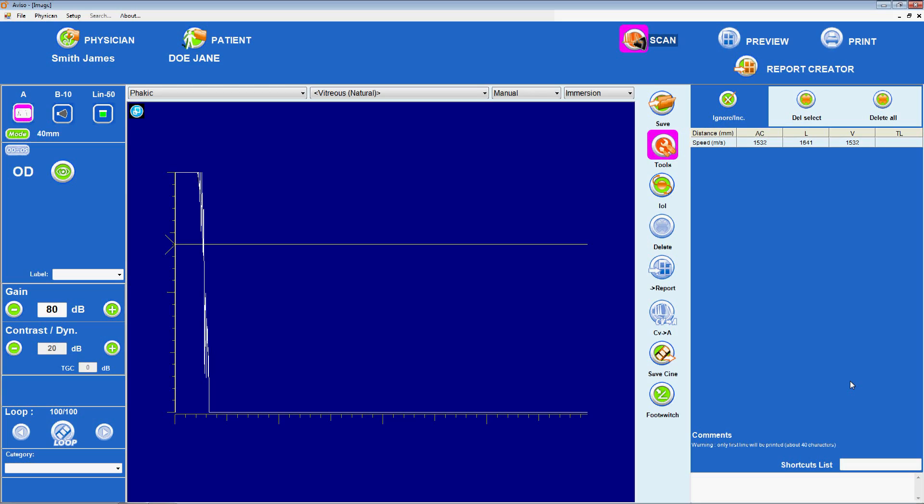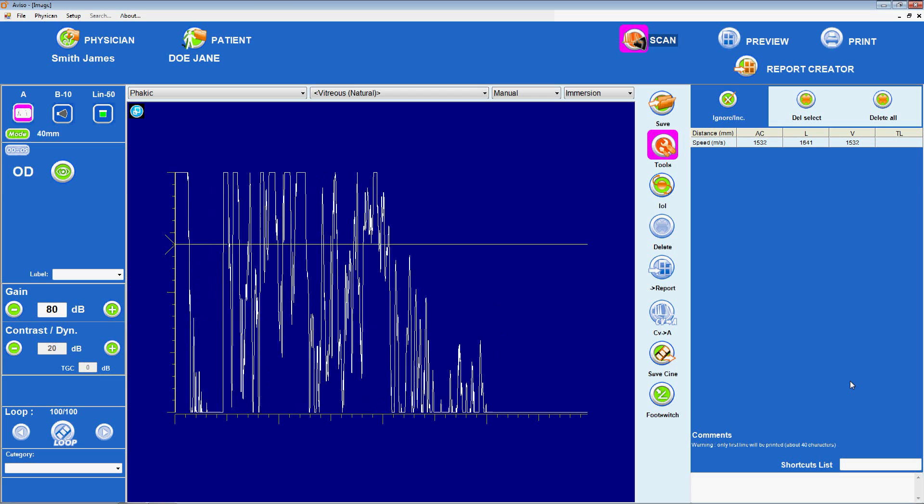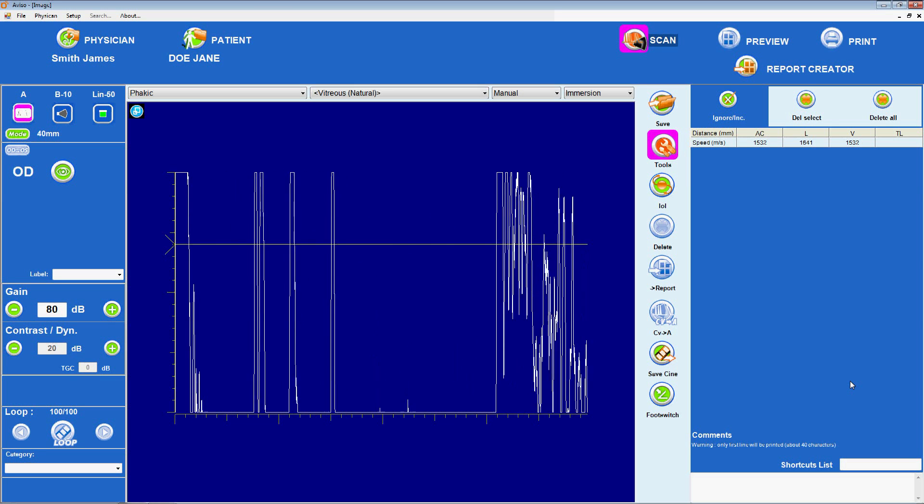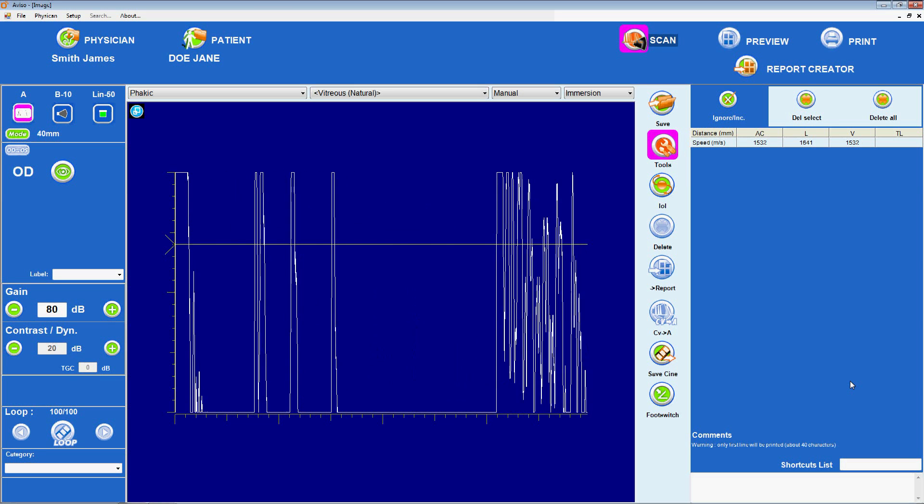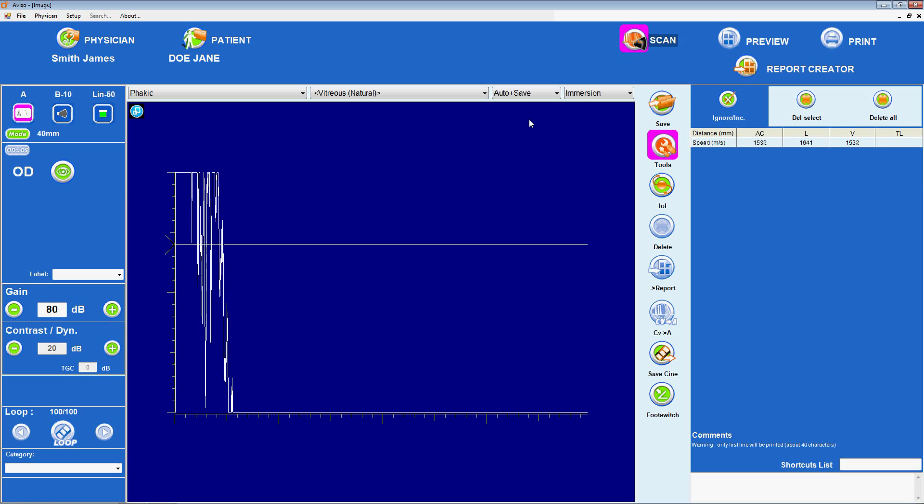When the exam is in progress, the image area at the center will show the A-scan being captured, and the result area on the right will list the measurements obtained.